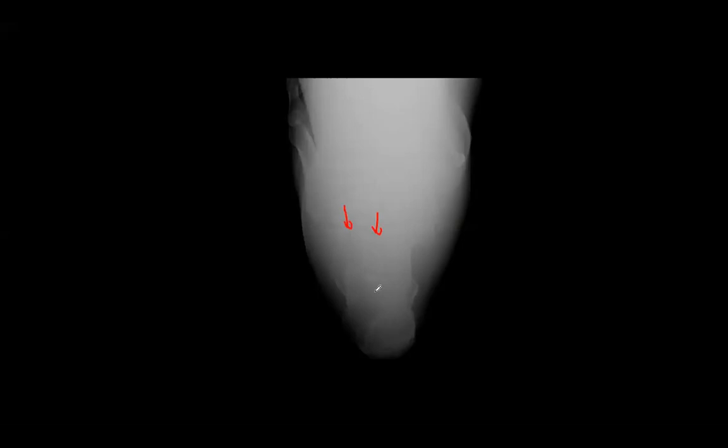And what structural deformities do we look at that are abnormal on a calc fracture? There's 3 we should remember. A widened calcaneus. Good. You see some of the lateral wall blowout there. Good. The length of the calcaneus, like the height.